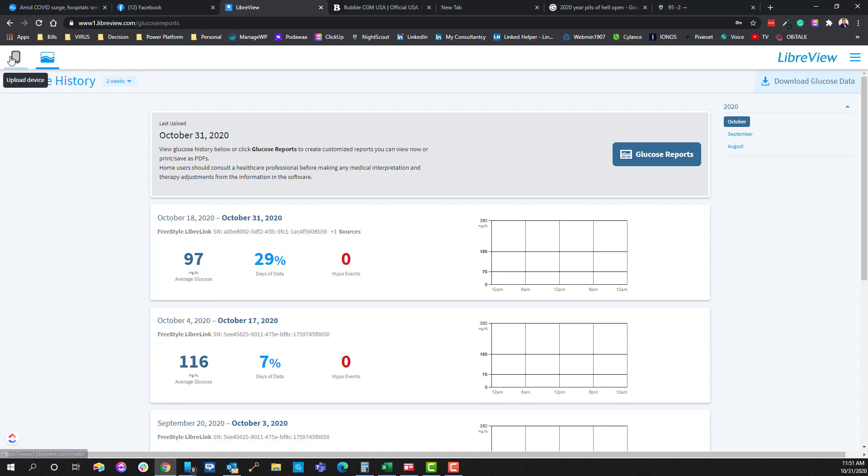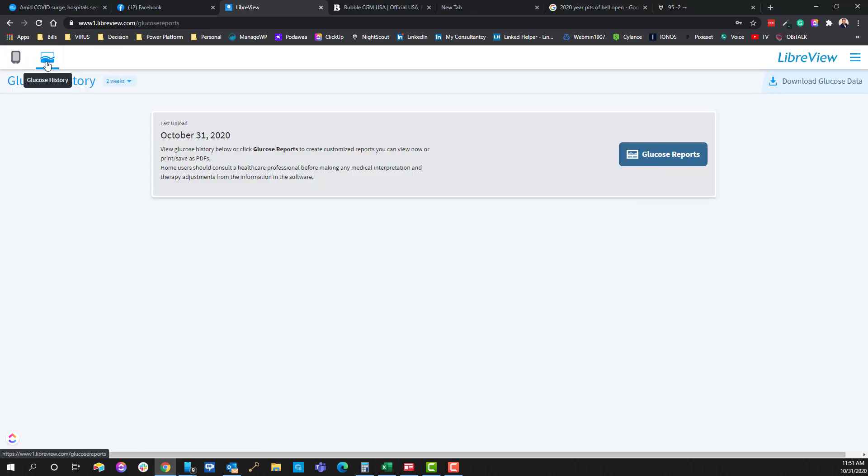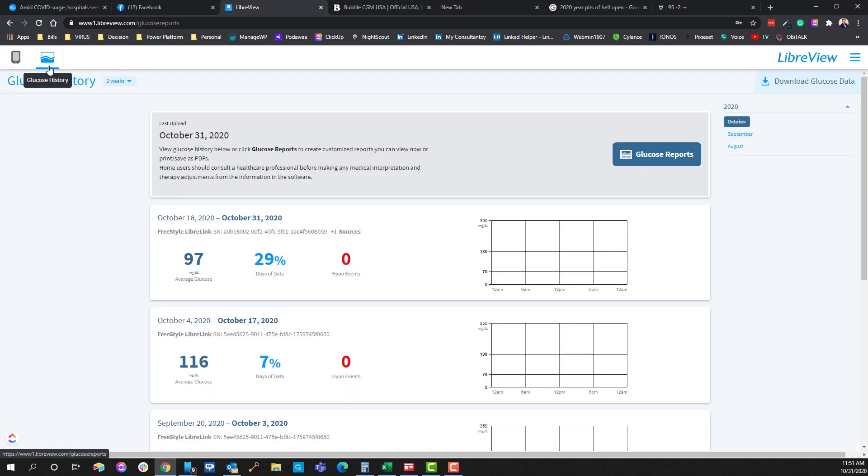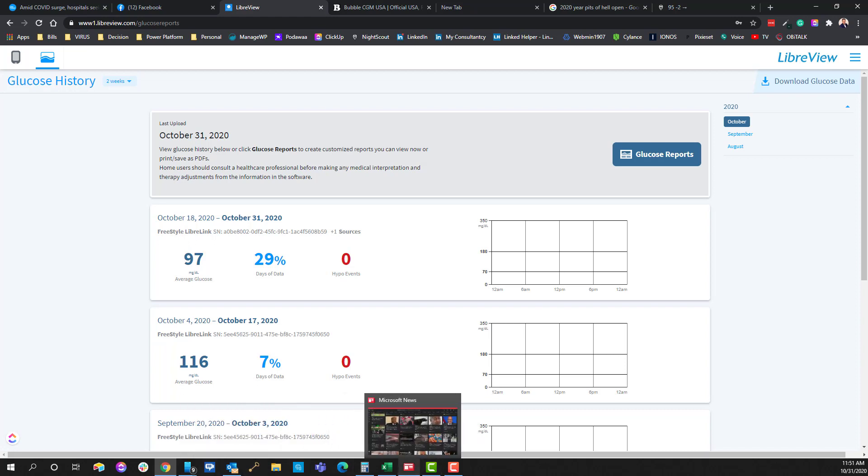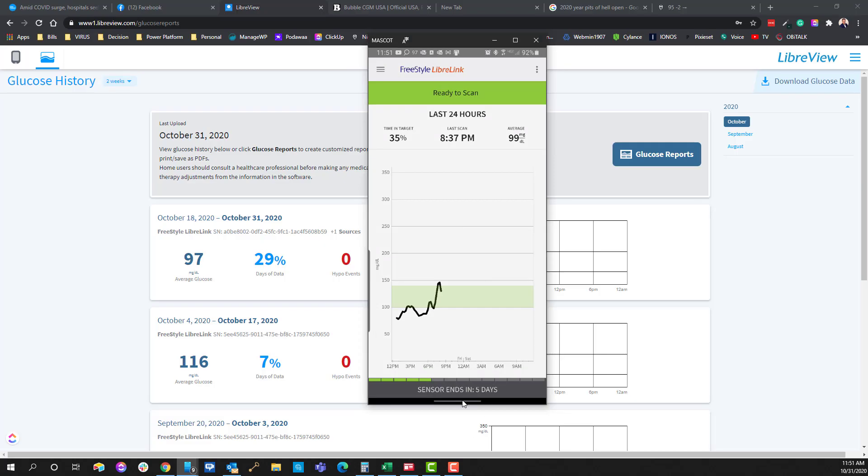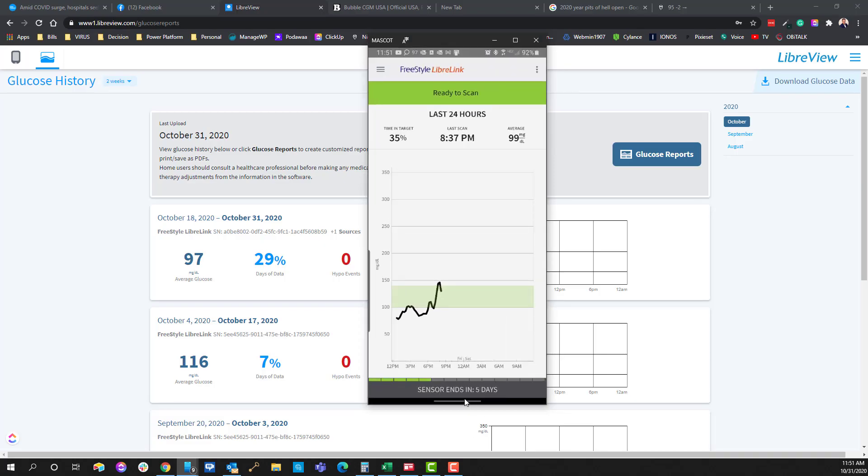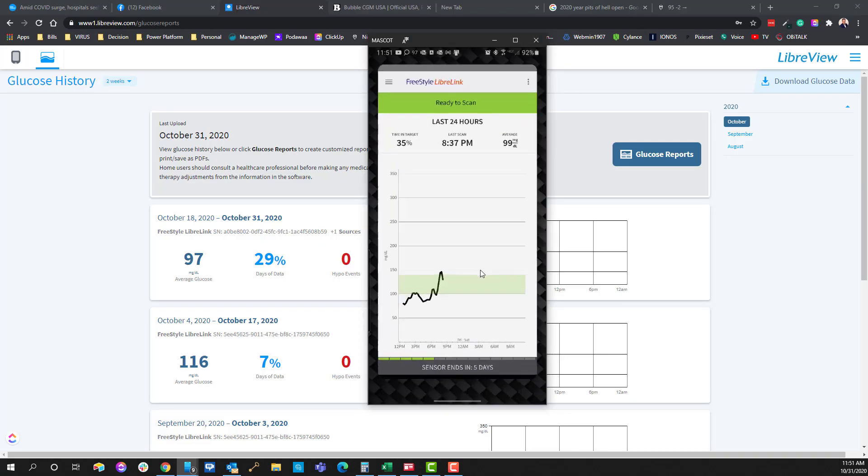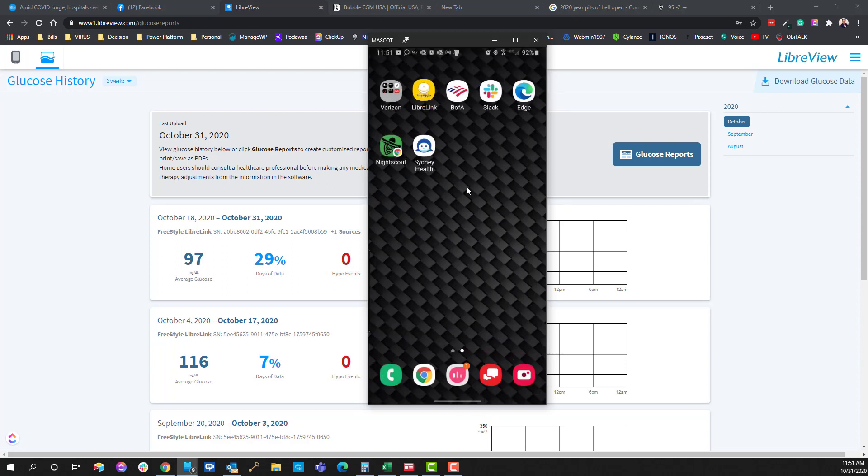So up here there's two switches. You have the device to upload the data and then the glucose history which is where you're going to want to be after you've connected the device over in the application. Let me bring that up real quick again. So we'll get out of this. It's hard to drive a phone on screen here.